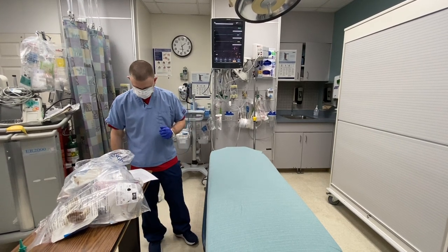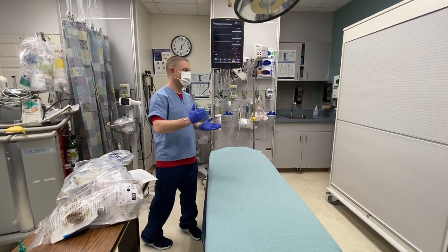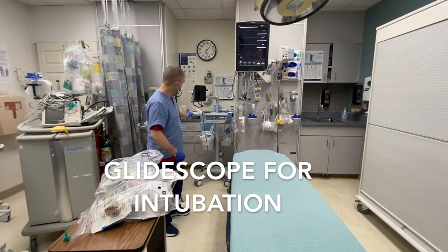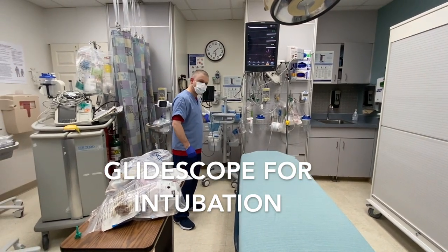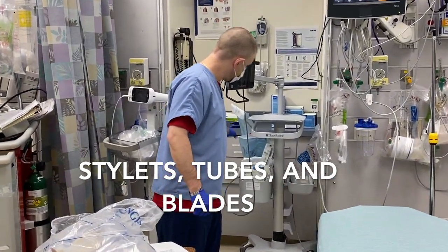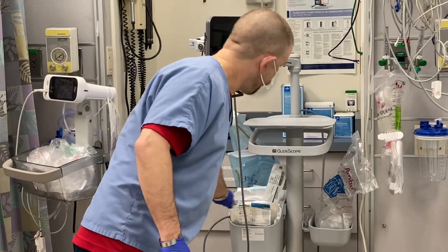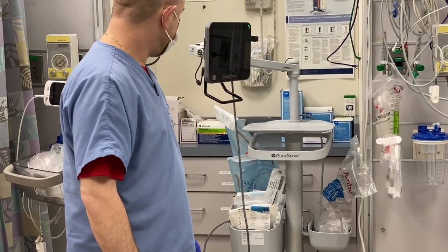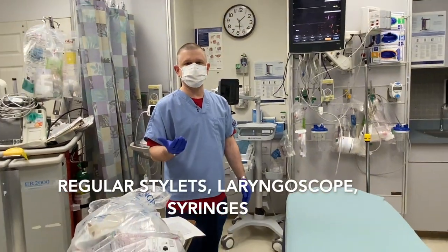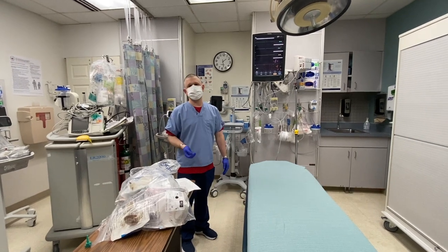And then we are going to talk about what we have to bring into the room, which is our GlideScope. On the GlideScope, you should have your GlideScope stylets. You should have an assortment of tubes and an assortment of hyperangulated blades. And you should have other things that you would normally use for intubation, like regular stylets and 10cc syringes.